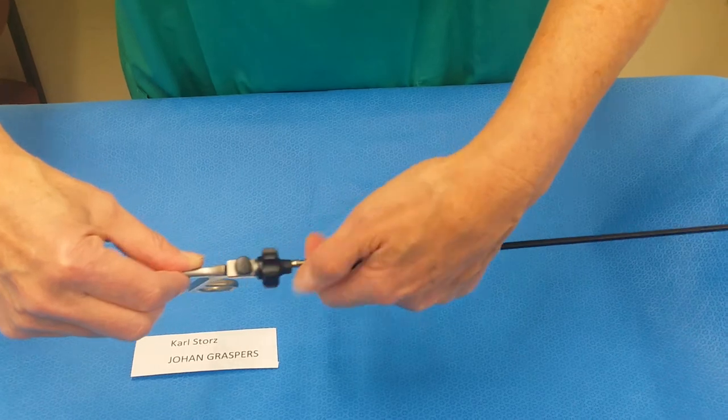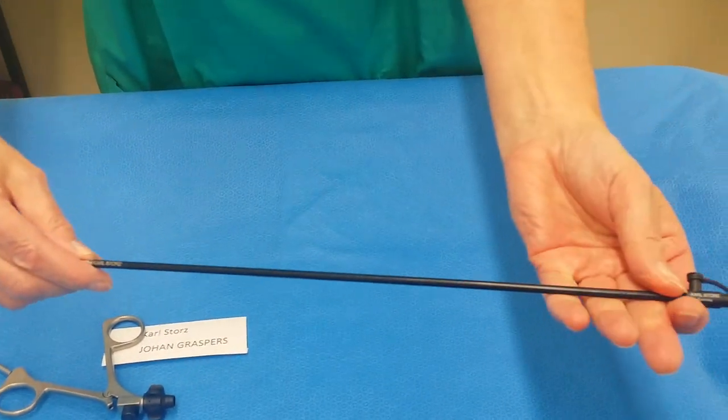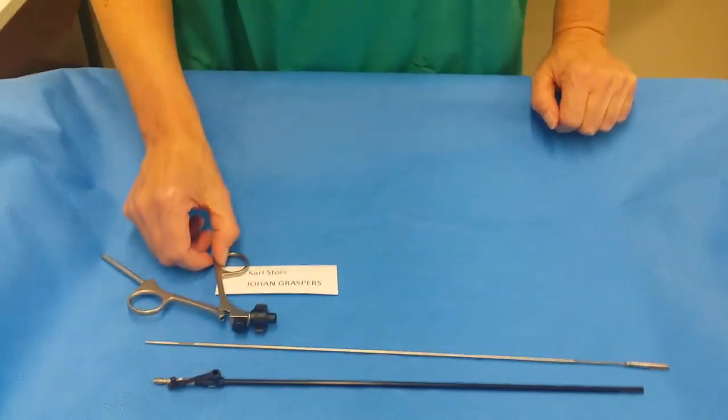Now to release it before you send it off to cleaning, you open the handle fully like that, press the button and it slides out. You twist 1/4 turn the other way and pull the insert out. And that's how you return it to the instrument box.